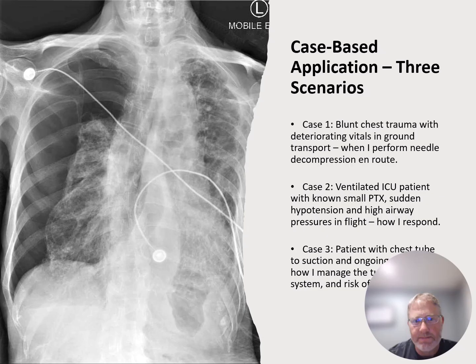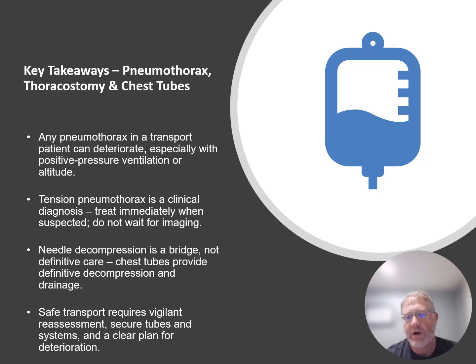Key takeaways. Let me close with the big points that you should carry into practice. Any pneumothorax in a transport patient has the potential to deteriorate, even if there's needle decompression, even if there's a chest tube in place, particularly in patients receiving positive pressure ventilation or with altitude changes in flight.